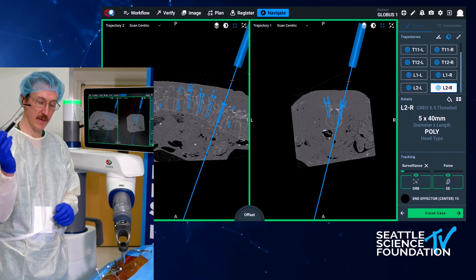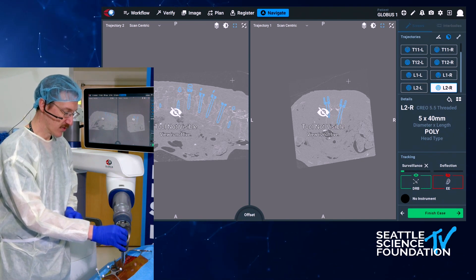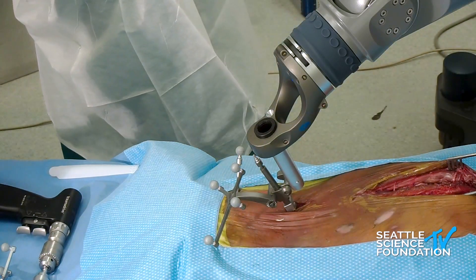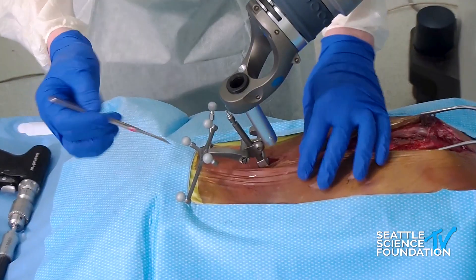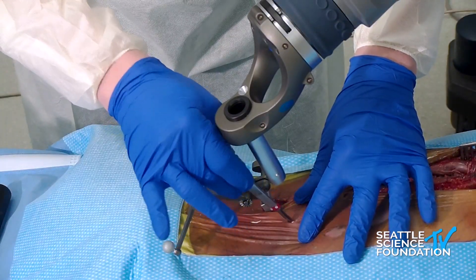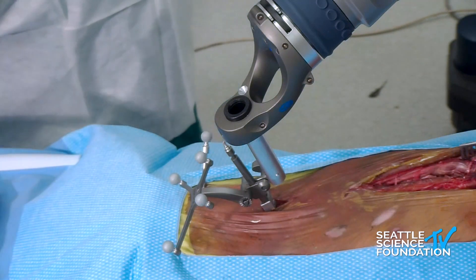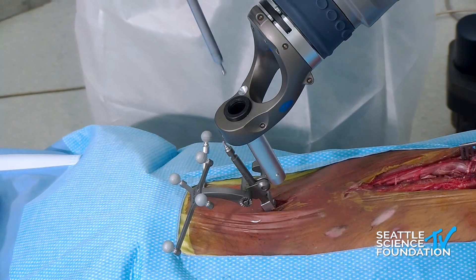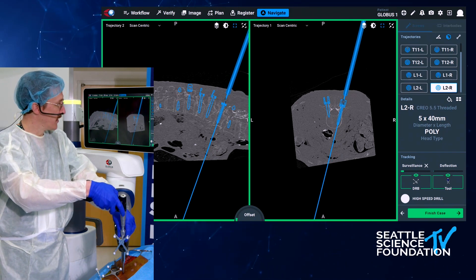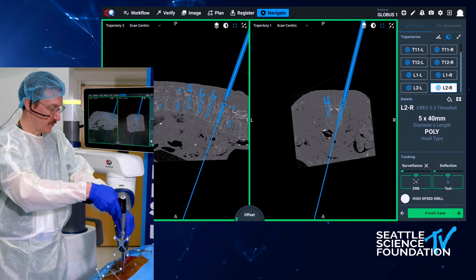Now for our purely percutaneous technique, I'm going to take the knife through the cannula and make my incisions. These knives are offset, so that you can turn it around and get a slightly bigger opening. In cadaveric tissue, we frequently have to enlarge that ever so slightly, just because the tissues aren't as pliable as when the patient was alive. Using the same green-as-go indicator, I'm going to take my burr and burr out the starting spot here. This will also help prevent skiving by having a flat area for the drill to engage.